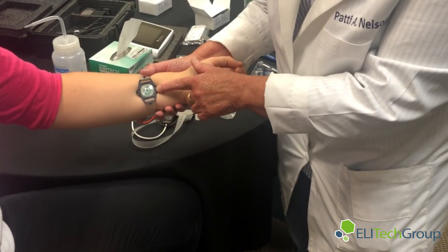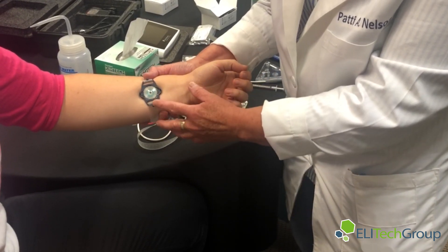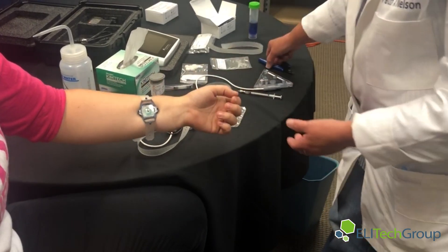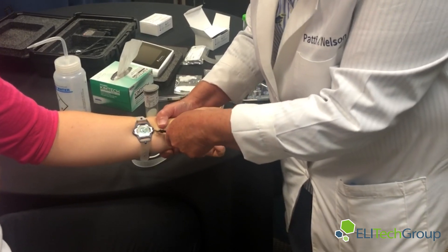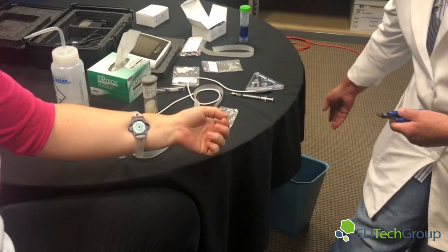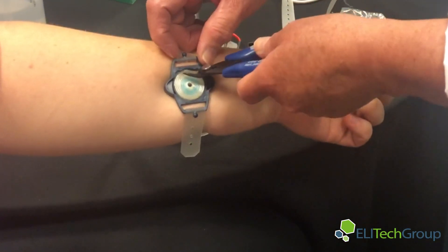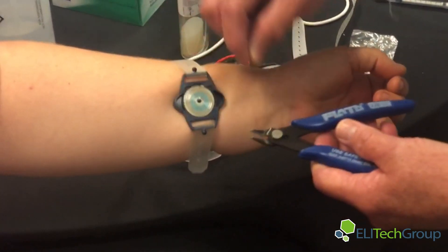To remove the sweat, collect it from the arm, and make sure we don't have a quantity not sufficient result, here are the important steps. You have your nippers — go through and pop the cover off, then throw it away. The nippers are good for finding the end of the micro-bore tubing, which is right here. Then you pull up gently.